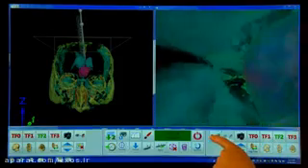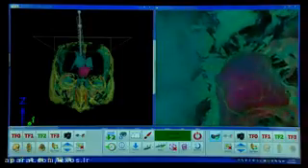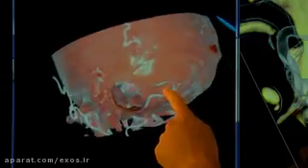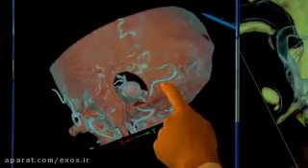And with the endoscopic probe view, we have the ability to represent what we would see on the screen at the tip of the probe. And this gives us the ability to appreciate, rehearse, and plan for endoscopic procedures. Here we have an additional aneurysm case where I'm demonstrating the segmentation properties and clear segmentation for vascular cases.